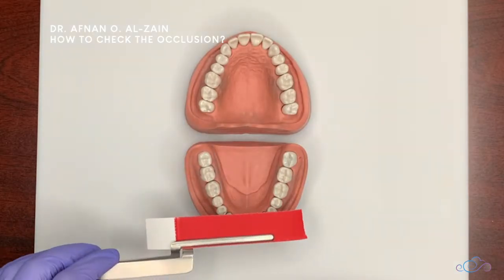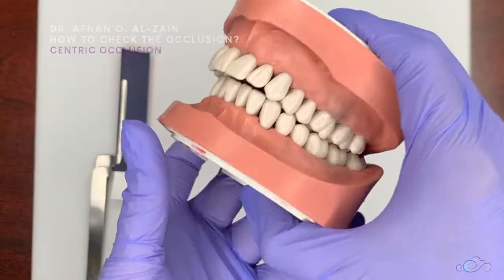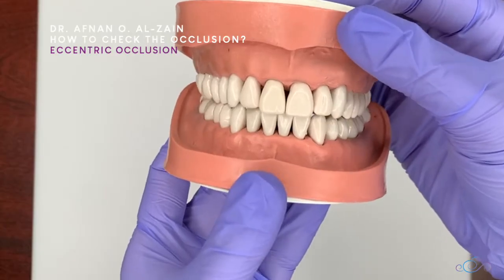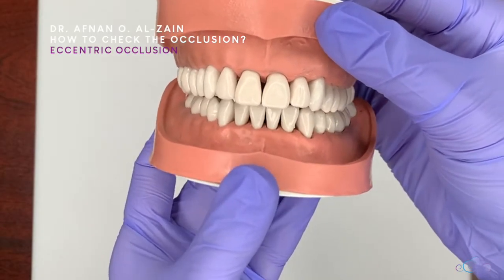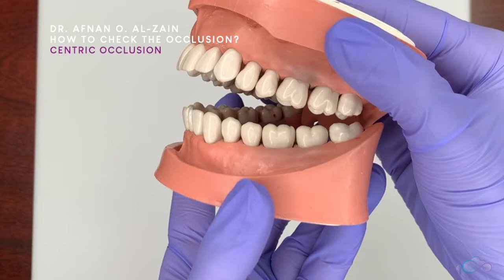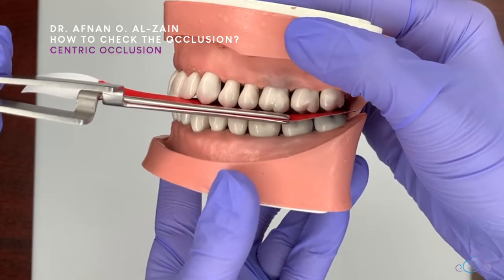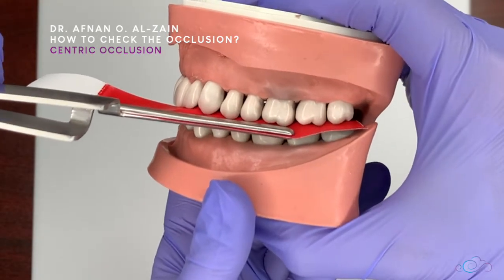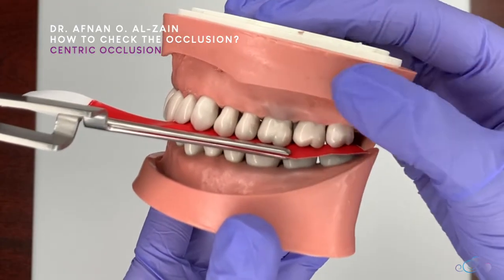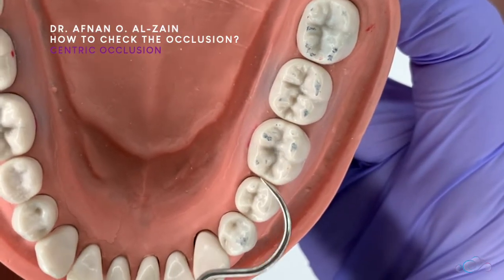To check occlusion, first we check centric occlusion, which is when the patient is biting on their back teeth, and then eccentric, which is grinding or chewing. We dry the patient's teeth first, then ask the patient to open, place the articulating paper on their teeth, and ask them to bite on the molars and close tightly. Then we tug or pull the articulating paper, ask the patient to open, and check the points or markings.